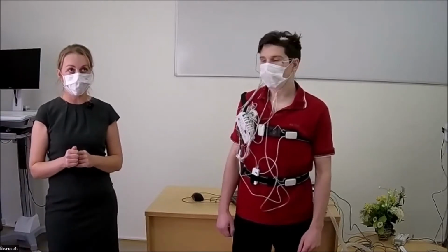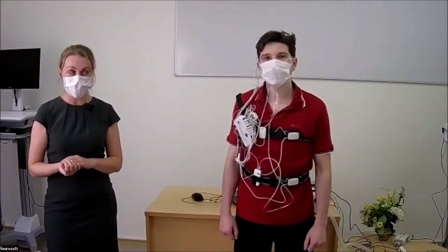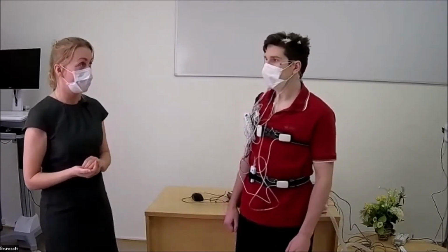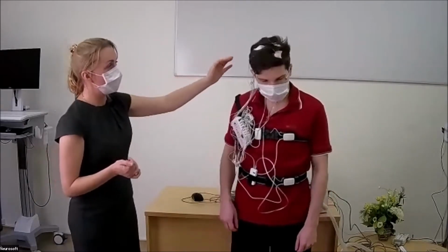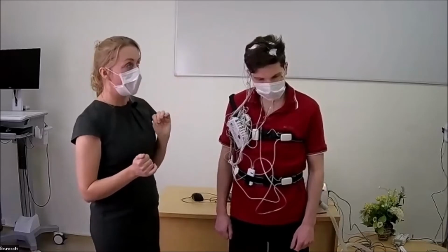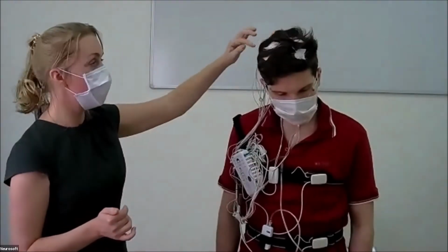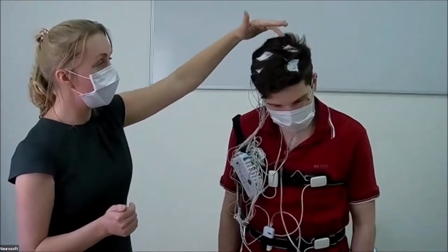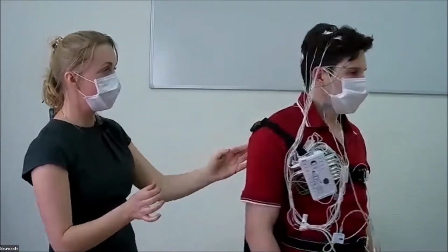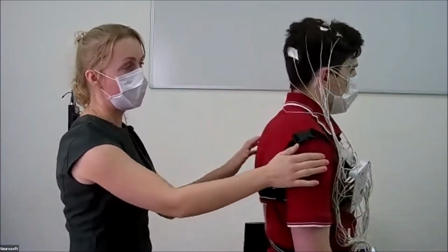And in this case, we use a reference which we put on the left mastoid. But as you can see, I put 6 EEG derivations. I put the derivations which I described, and I put the backup electrodes. So this is F3, F4, C3, C4, and we have 2 occipital electrodes.